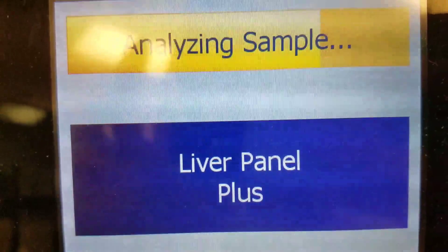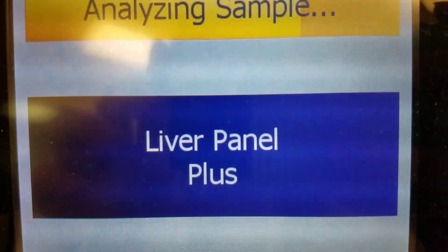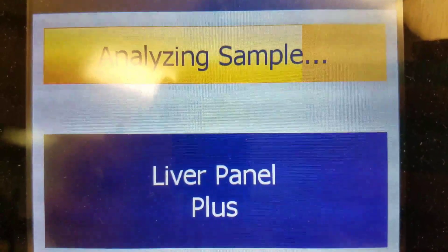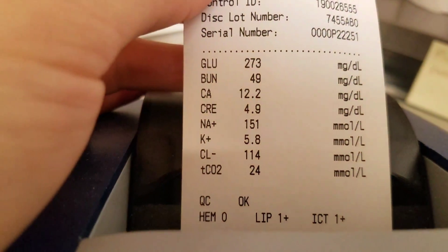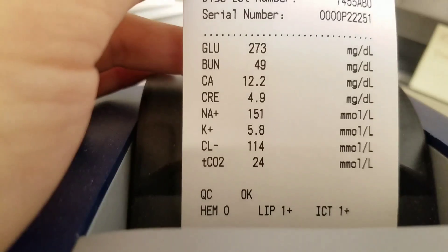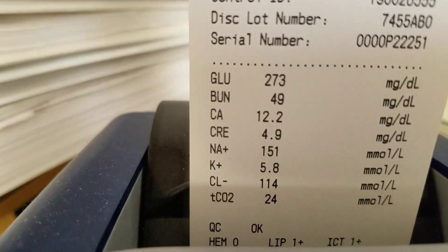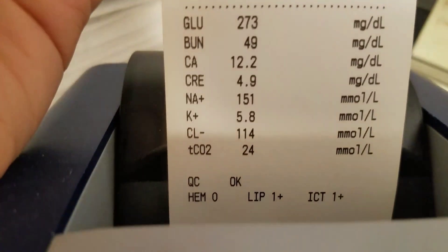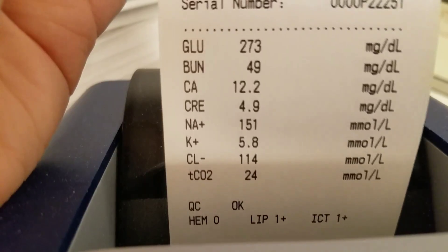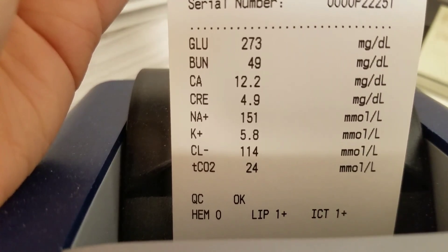Here you can see the analyte which I'm running QC is about three-fourths of the way done. So that's what it looks like. Also, I ran the BMP earlier. Here's what the results can look like on that — that's just your basic stuff. And at the bottom, it also gives the HIL flag — so hemolysis, lipemic, and icteric.